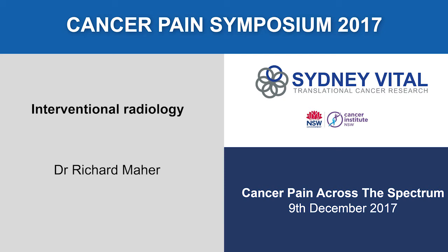So percutaneous ablation. What are our options? RFA is the most commonly used or widely used. Most literature has been around the longest. Microwave has come into play and replaced RFA in certain areas, and cryoablation also has replaced. Predominantly used in pain patients for bone metastases in both the appendicular skeleton and the spine.